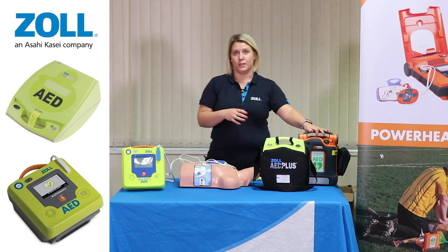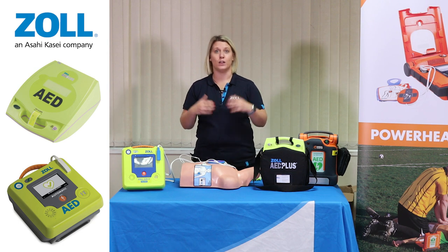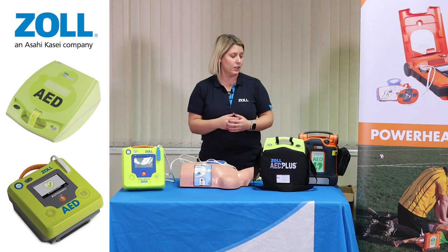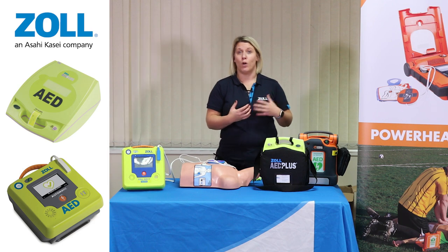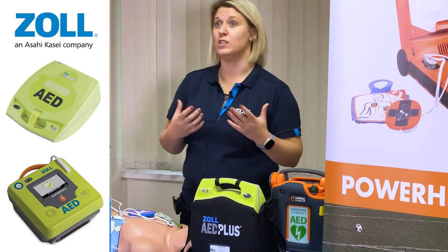There's also an inbuilt thermometer. So for example, if it's stored in an external location in a cabinet and there was a situation where there was a power cut, if a device became too cold it would alarm and notify you that it would need to be taken into a warmer environment, purely because we know that lithium in cold temperatures depletes.